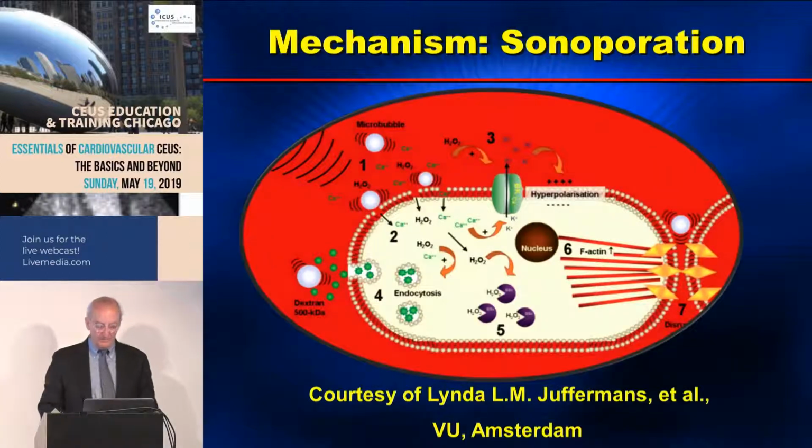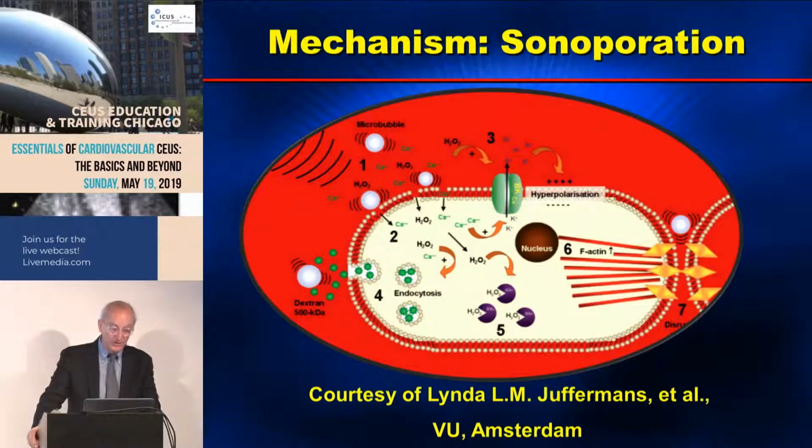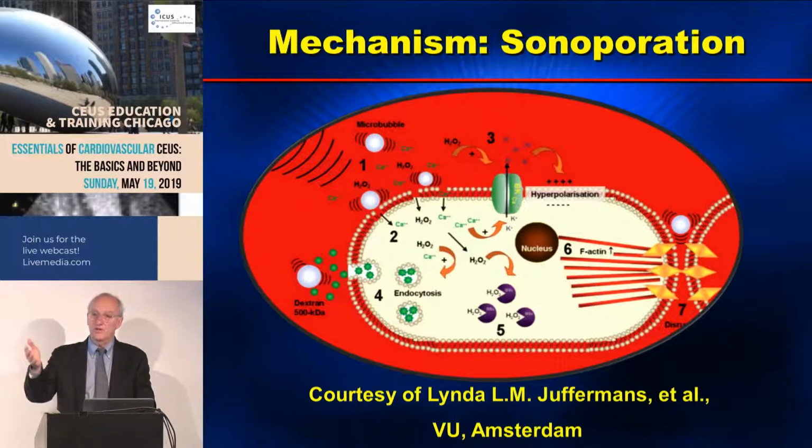Fascinating work. Much of this work has been done by many people. Linda Jufermans wrote her PhD on this. There's probably 6 different mechanisms. Now, if you look up here, here's the bubble, here's the ultrasound beam, and you see all the different pathways into this cell. Fascinating work, but best shown by Alfred Yu when I showed you that video. That's really what's going on.